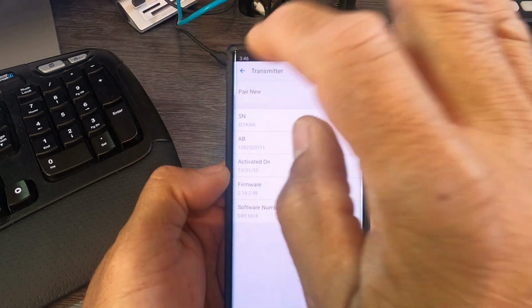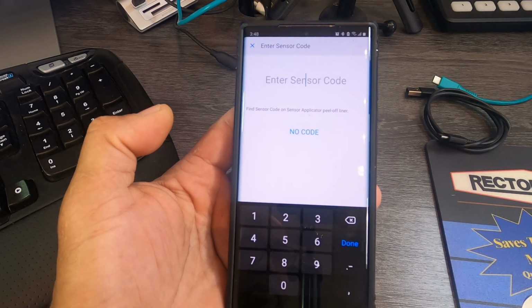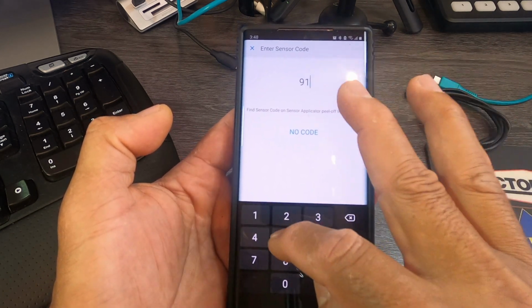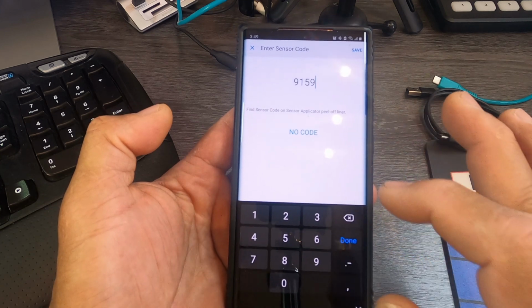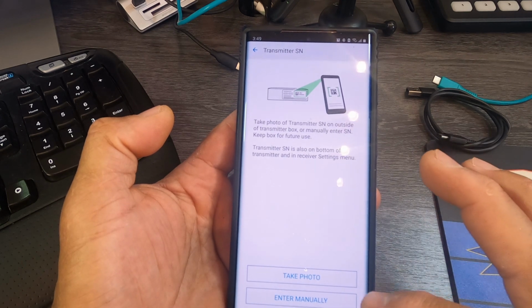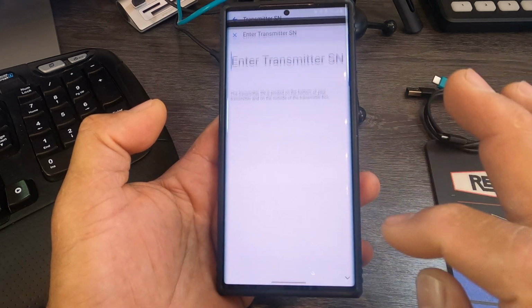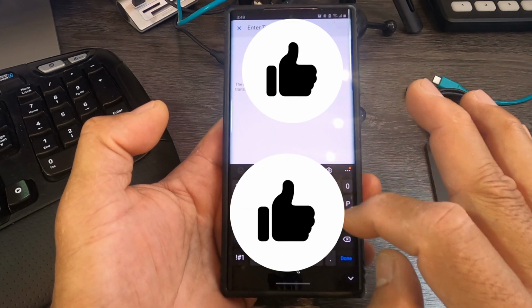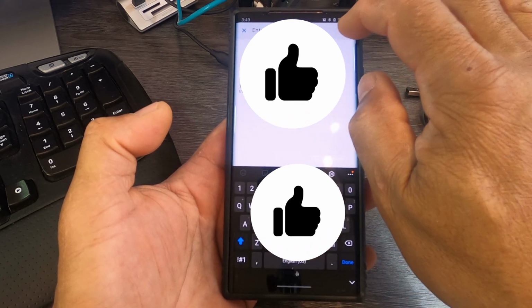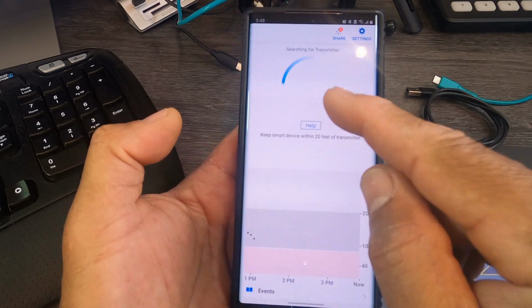So I want to go in there and pair new, and you want to enter code, enter manually. Then you get the code. This is my code right there. I'm going to put it in: 9159. We click save that, confirm, successful. And now we want to put in the transmitter serial number, enter manually. Confirm, successful, next.